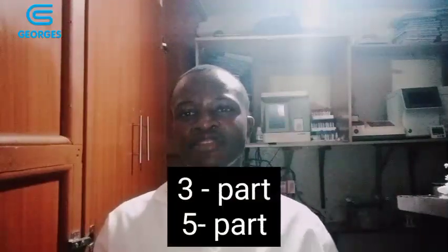We have the 3-part and the 5-part. The one producing a light behind me is a 3-part full hemogram machine. And we also have the 5-part. The difference between 3-part and 5-part full hemogram machines is that the 5-part machine is actually able to break down to you the different types of WBCs.